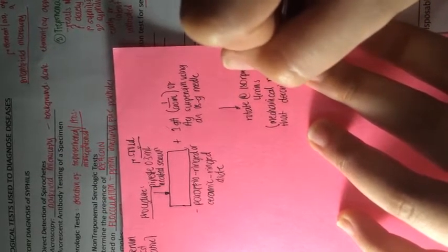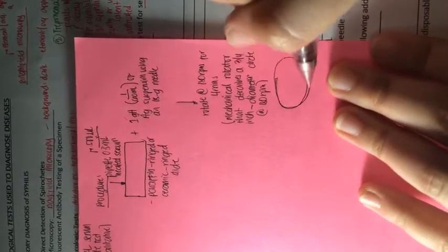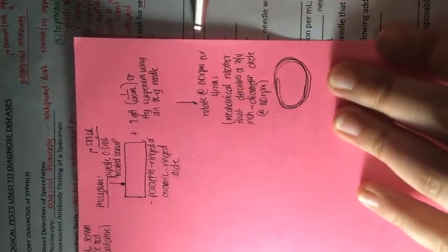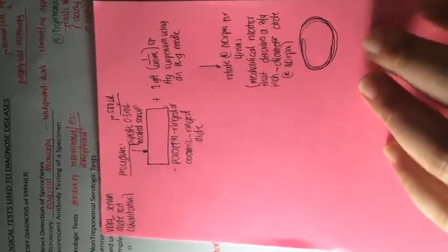should describe a 3/4 inch diameter circle at 180 RPM. So in every rotation, for example, if this is the circle, it should cover a 3/4 inch diameter circle to allow homogeneous distribution of the solution, so as to initiate equal or maximum sensitization between the antigen and the antibody in our serum.